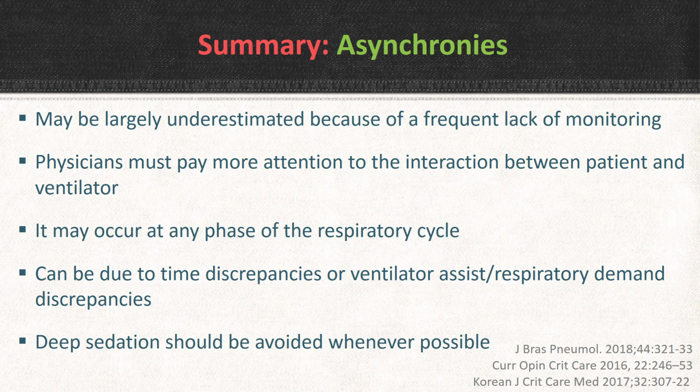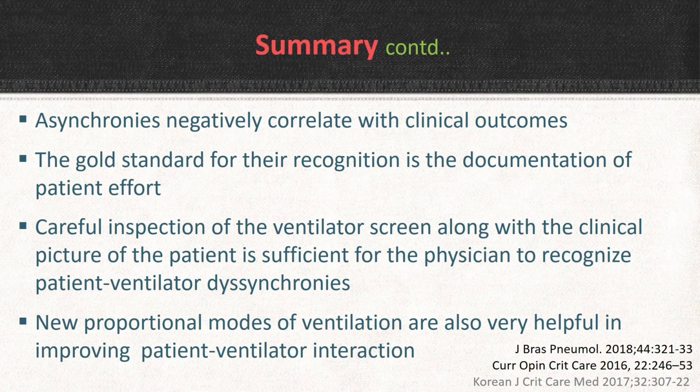Deep sedation should be avoided, which is also one cause of asynchronies. Asynchronies negatively correlate with clinical outcome. They may cause prolonged ventilation and worse outcome.